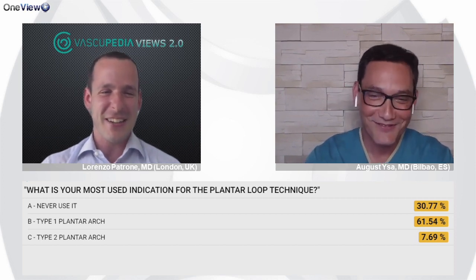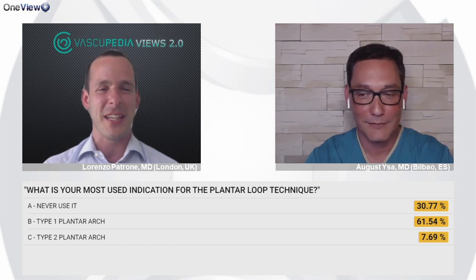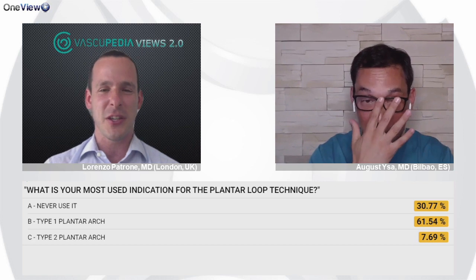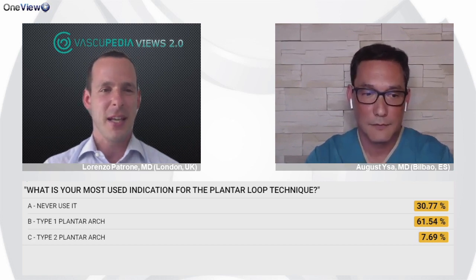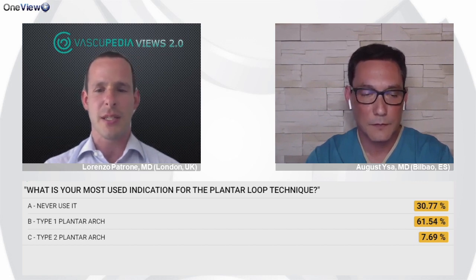Okay, the other poll is: what is your most used indication for the plantar loop technique? Never use it is 30%, and I'm happy that we have a third of the people who joined us, because that means they are interested in developing something new. Type 1 plantar arch is most of the people. Type 2 plantar arch is roughly 8%. Your comments on that?